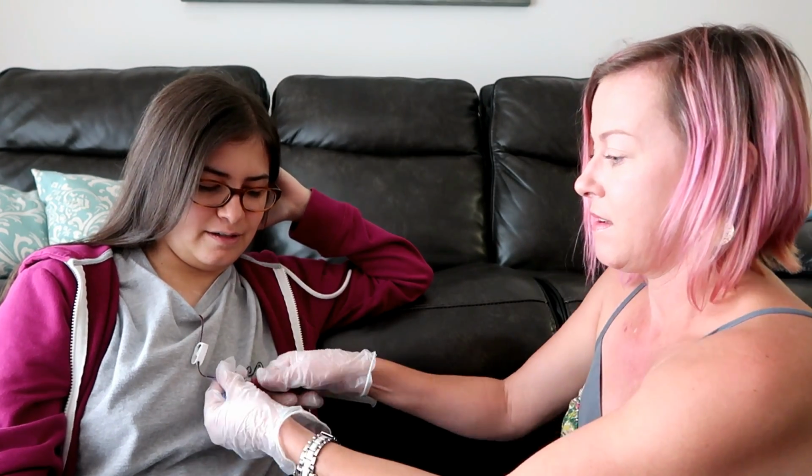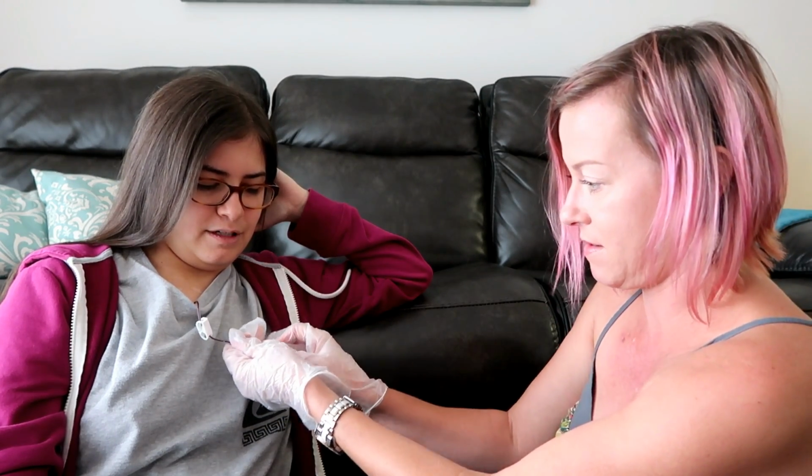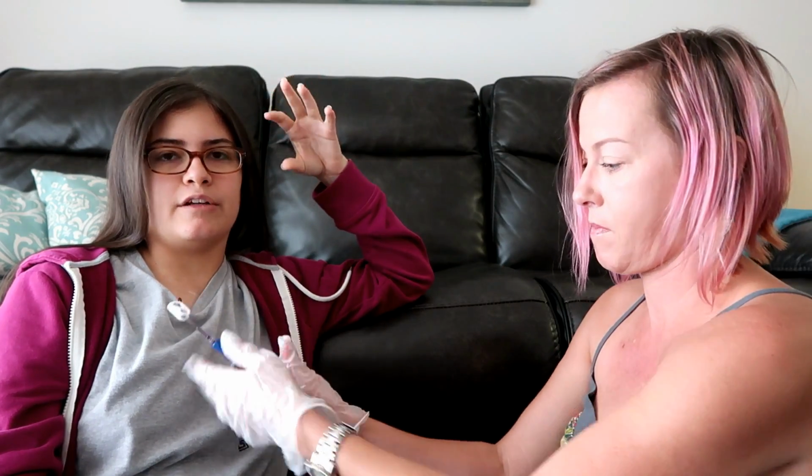I know. Jaquie does not have the best veins, and she does not really like to be stuck. I don't. And my port really is so finicky. It could work one moment, and then literally the next moment it'll stop working. So this is how the vacuum works. It just sucks the blood out for us.